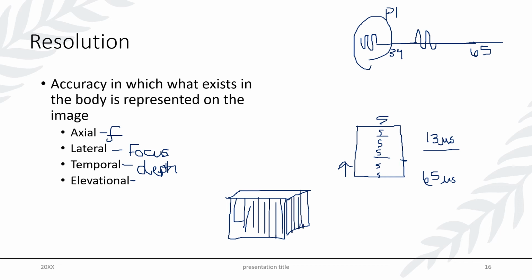Now, because we are basically displaying a 2-dimensional image with 3 dimensions of information, we are going to be basically averaging each of these layers of information to provide our full image.